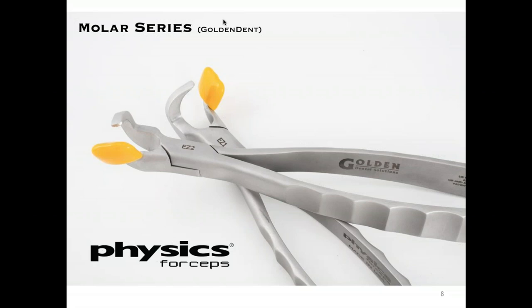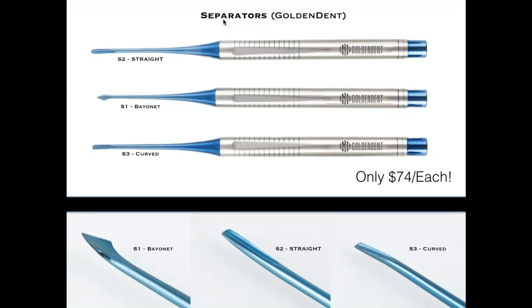But the other nice feature about this set is it does allow you to place the bumper on the buccal or the lingual side of the tooth. So it does give you a little more flexibility, where with the standard series, the bumper is always going to be on the buccal side. You lose a little bit of your leverage with the set, but you do get further back into the mouth.